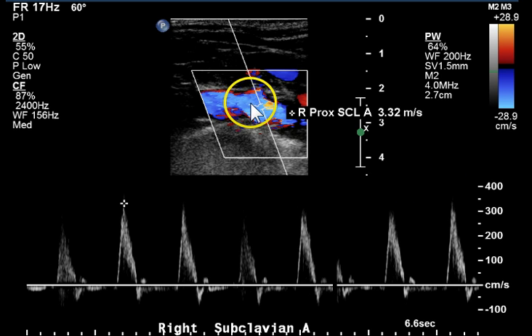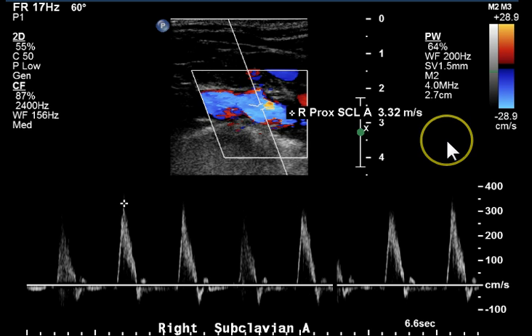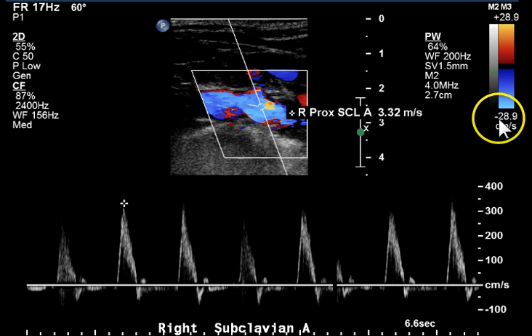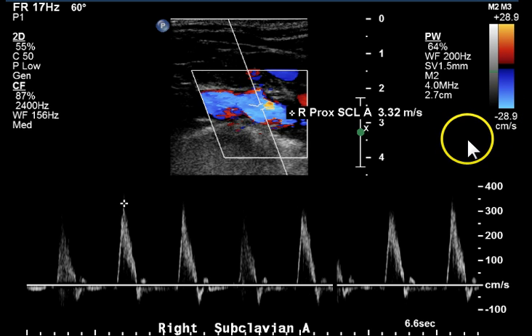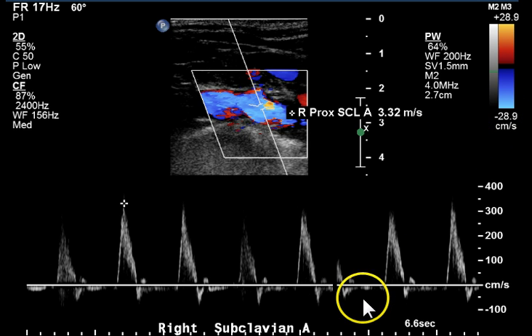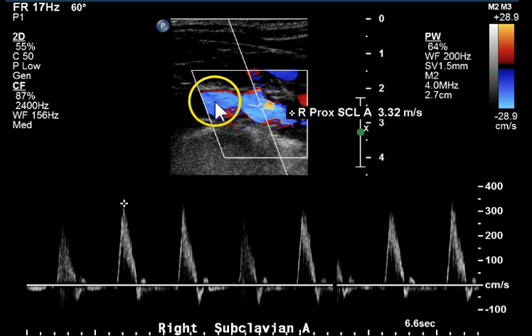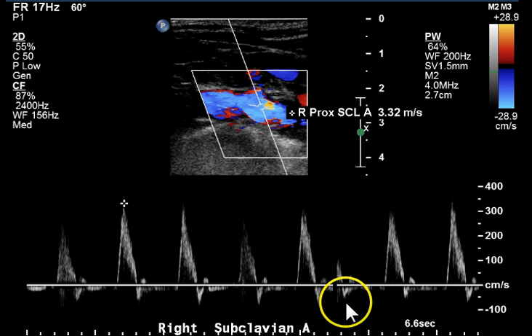The flow in the color portion of this image is blue because the image was updated at a time when flow was in a reverse phase.